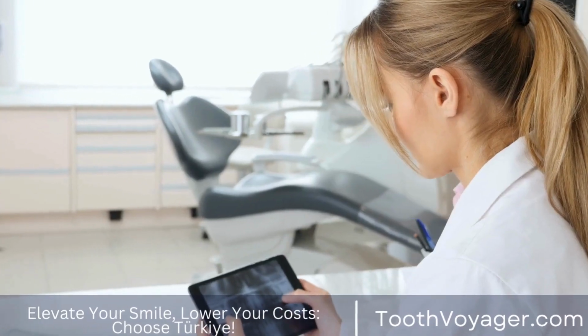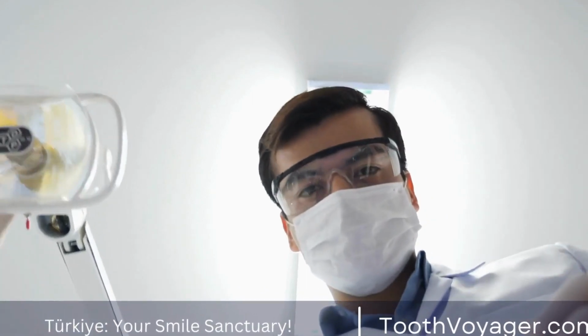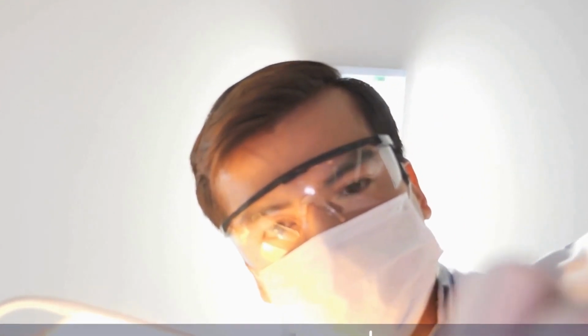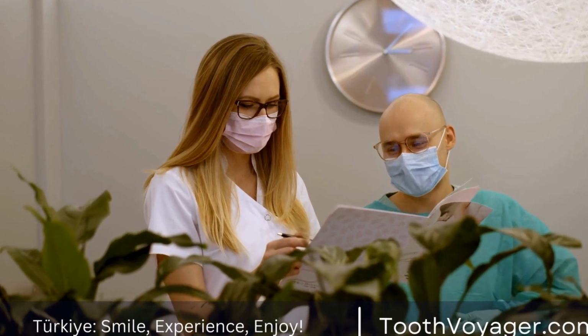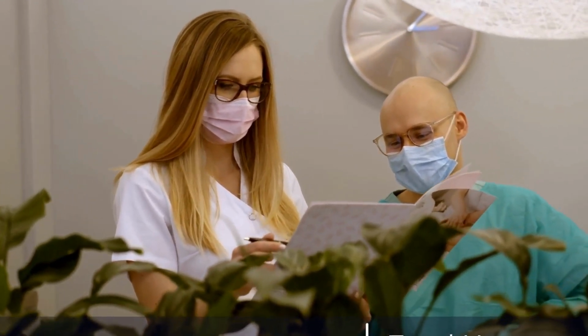The bone grafting process. The bone grafting process typically begins with a consultation with a dentist or oral surgeon who will assess the patient's bone density and determine the best course of action. If bone grafting is deemed necessary, the procedure will be scheduled and performed under local or general anesthesia.